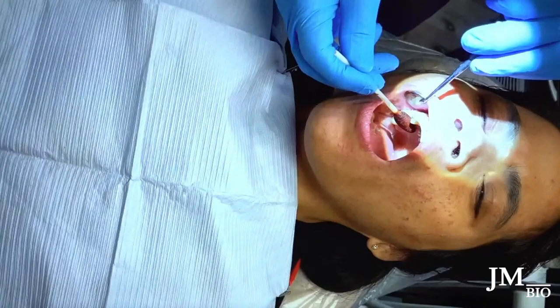This is a video of immediate placement at tooth number four. I'm doing a betadine scrub — this is my routine. The patient is already numb.